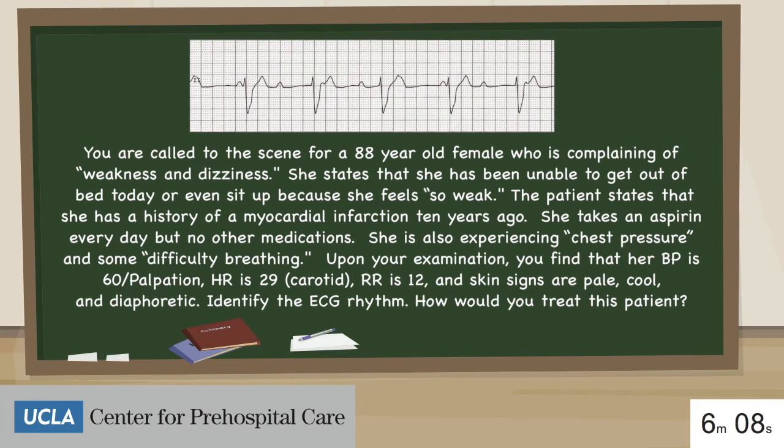We're going to consider giving this patient 0.5 milligrams of atropine IV, but since she's unstable and atropine's unlikely to work on a 3rd-degree heart block, we can go straight to pacing. We'll set the rate at 70 BPM and increase the milliamps until we have electrical and mechanical capture. We can give dopamine IV piggyback, 2 to 20 micrograms per kilogram per minute, or epi, 2 to 10 micrograms per minute IV piggyback for her blood pressure. We'll continue to reassess and reevaluate en route.